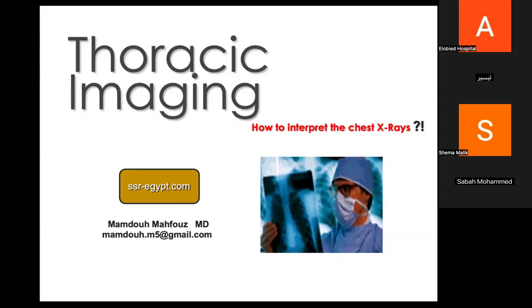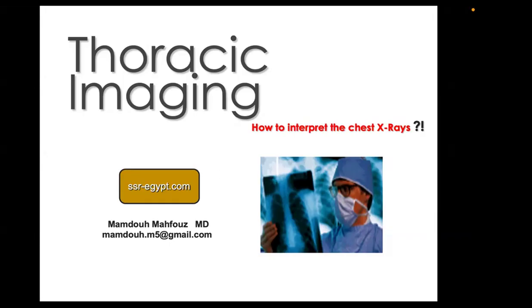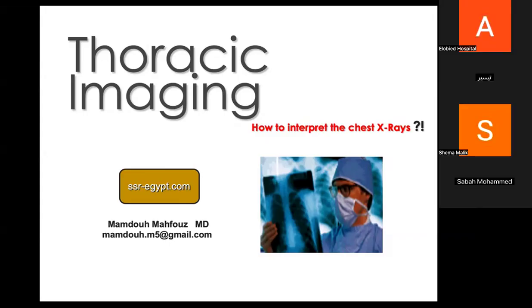Today we're going to touch on a very important topic, which is the chest radiograph. So why did we select the chest radiograph in particular? Why didn't we select any other topic? We selected this topic for one reason: the chest radiograph is the most frequently requested imaging test in every radiology department worldwide. If you go everywhere inside Sudan, outside Sudan, you will find that the most frequently requested imaging test is the chest radiograph.